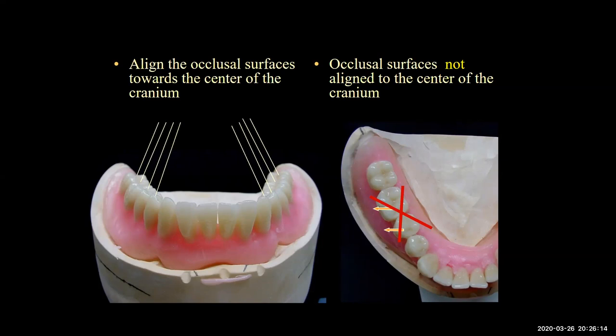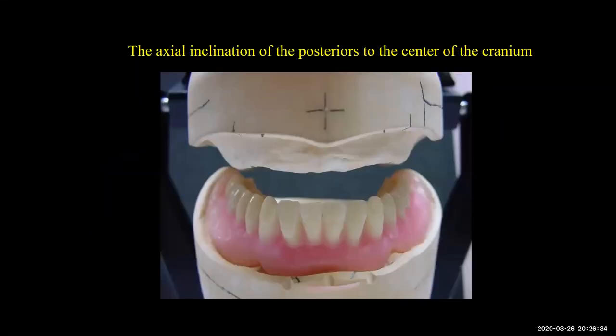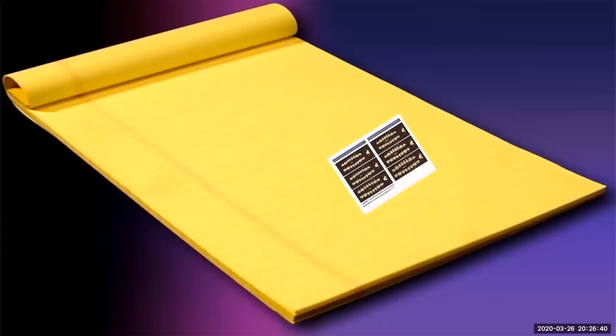The only time I'll do that is when I'm setting lingualized occlusion, because I want that lingual cusp of the upper going right into the central fossa of the lower, and it's going to relieve any off-axis stress on the implant and also reduce any ridge absorption on the ridge. So it really works out well with lingualized occlusion. A lot of patients find that more comfortable. We want the axial inclination of the posteriors to be towards the center of the cranium, as you can see here.